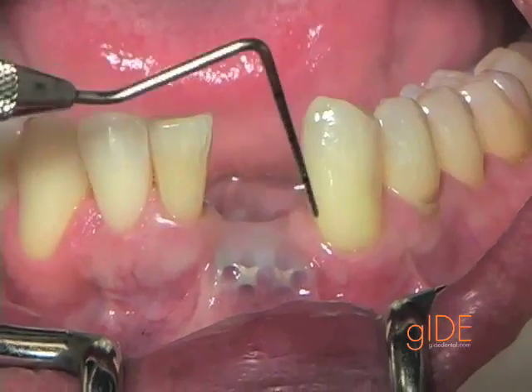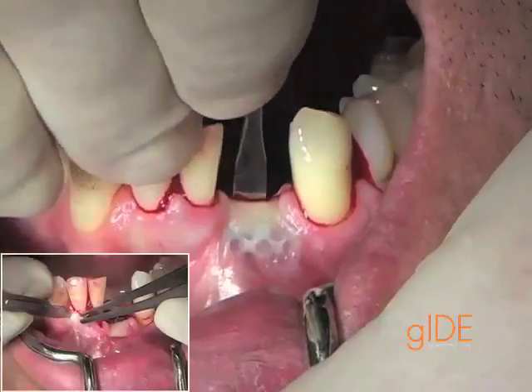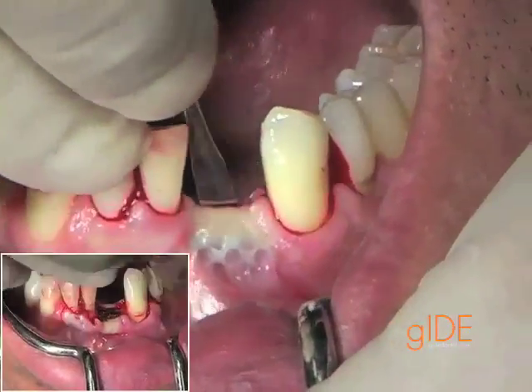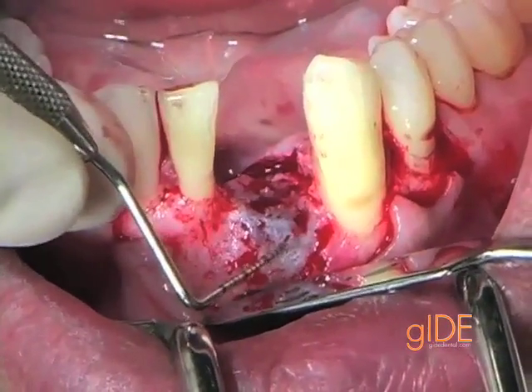We are now looking at seven months after the ridge augmentation and extraction procedure. A very careful elevation is performed to avoid traumatizing the thin tissue, and now we are evaluating the quality of the bone.